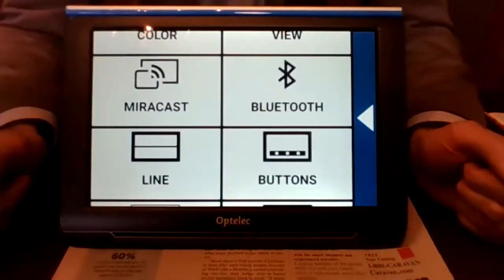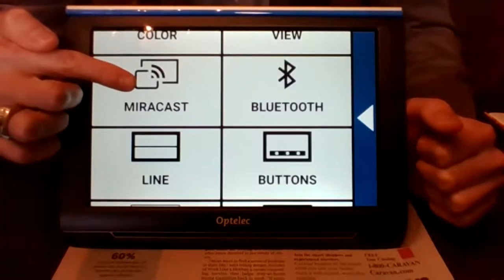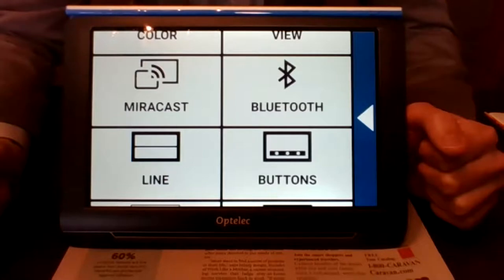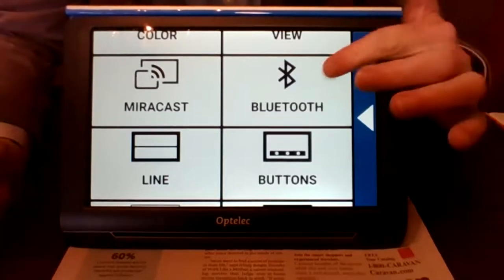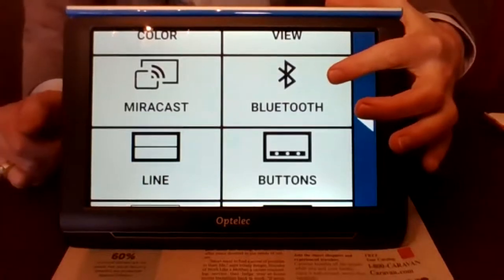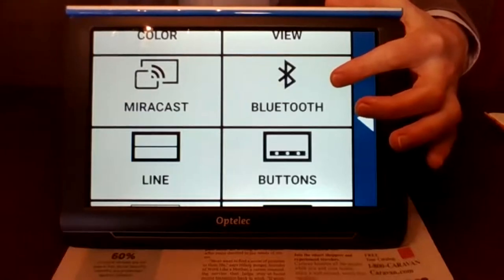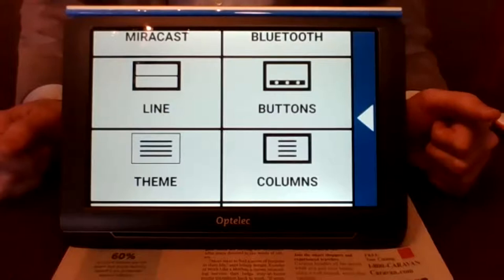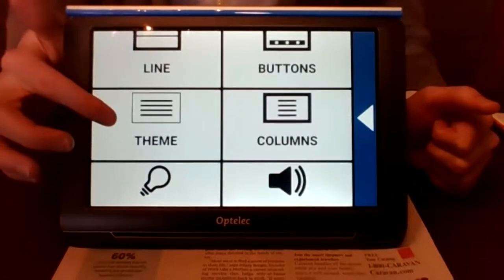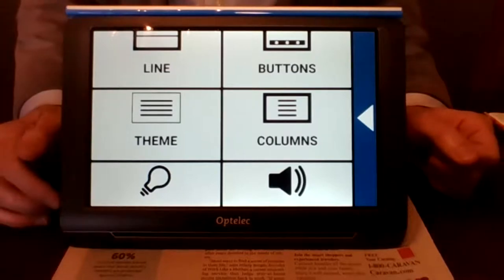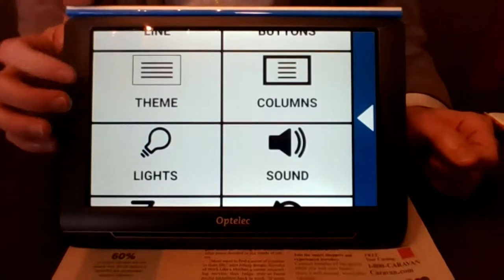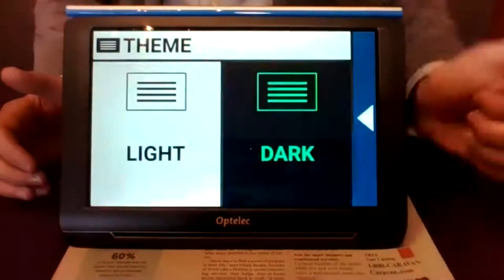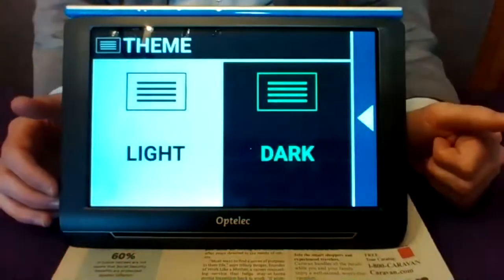Bluetooth is a great feature — this is compatible with Bluetooth 4.0, so you can have the privacy of Bluetooth headsets. It also works with some hearing aids. The reading lines option is available here, as well as columns settings — you can choose to ignore or include columns. For example, you want the newspaper to read in columns, but you don't want a bank statement to read in columns. There's also a theme option — this is a great easy feature. The onscreen controls are generally black on white background, but if someone is using reverse contrast, all the menu system should also be in reverse contrast. The theme setting lets you invert the control theme of the device.